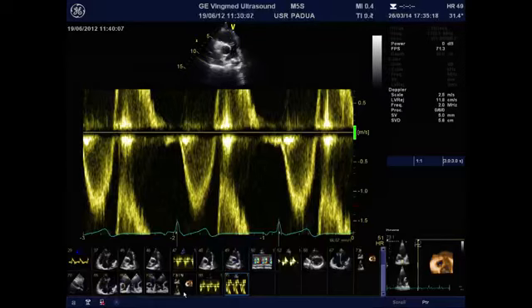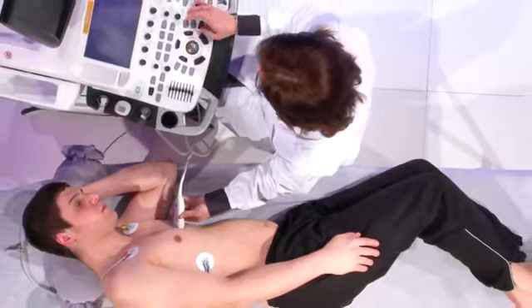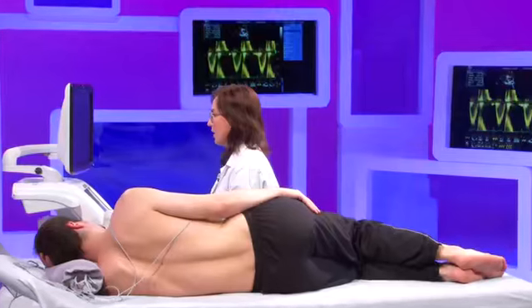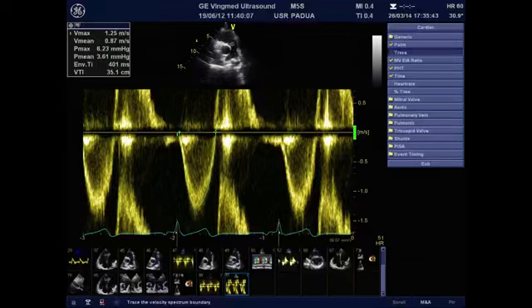this flow with pulsed wave Doppler, the antegrade flow across the pulmonary valve, and we can measure the velocity time integral, again using the modal velocity, like this. And you will obtain a number, 35, which is significantly large.